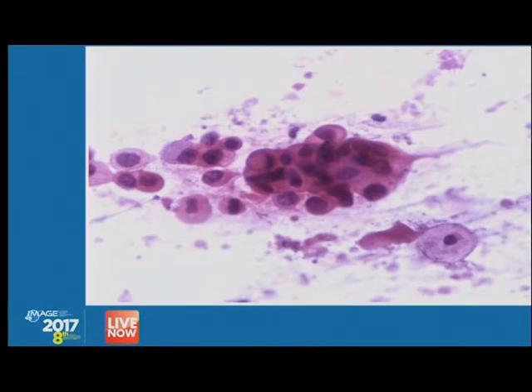And we are waiting also for the histological specimen. Of course, it needs more time, and probably will be ready for today, but we have already the diagnosis on this material, so we are very happy on what we took from the biopsy.